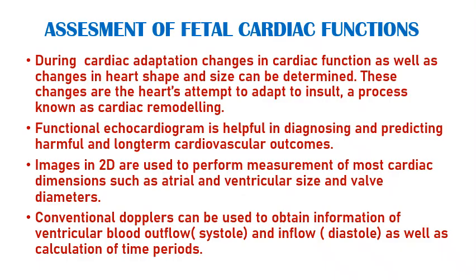During cardiac adaptation, changes in cardiac functions as well as changes in heart shape and size can be determined. These changes are the heart's attempt to adapt to insult, a process known as cardiac remodeling. Functional echocardiogram is helpful in diagnosing and predicting harmful long-term cardiovascular outcomes. Images in 2D are used to perform measurement of most cardiac dimensions such as atrial and ventricular size and valve diameters. Conventional Dopplers can also be used to obtain information on ventricular blood flow in both systole and diastole, as well as calculation of time periods.